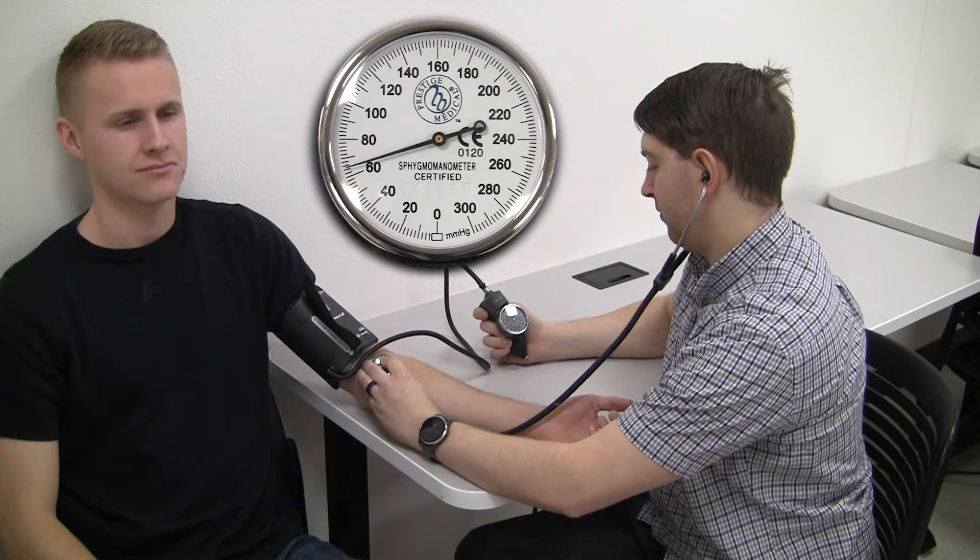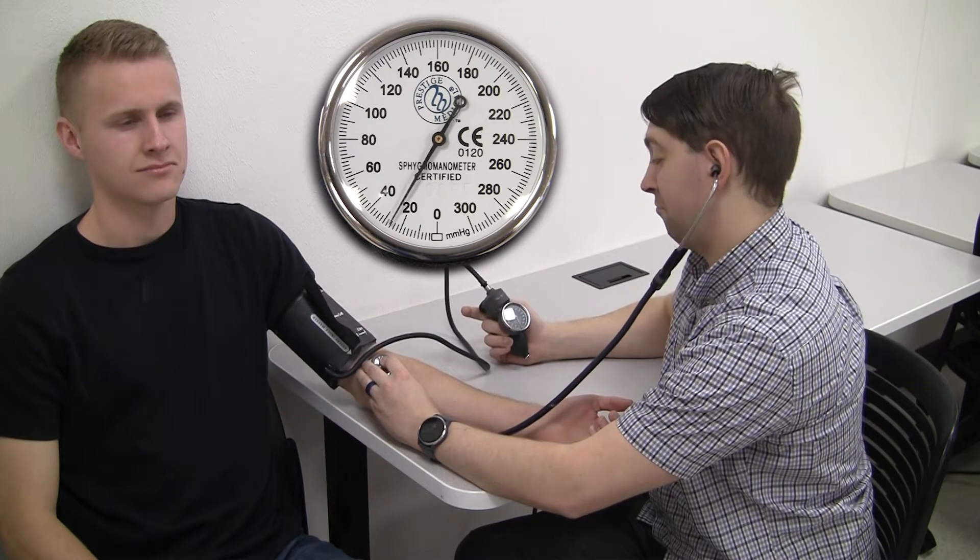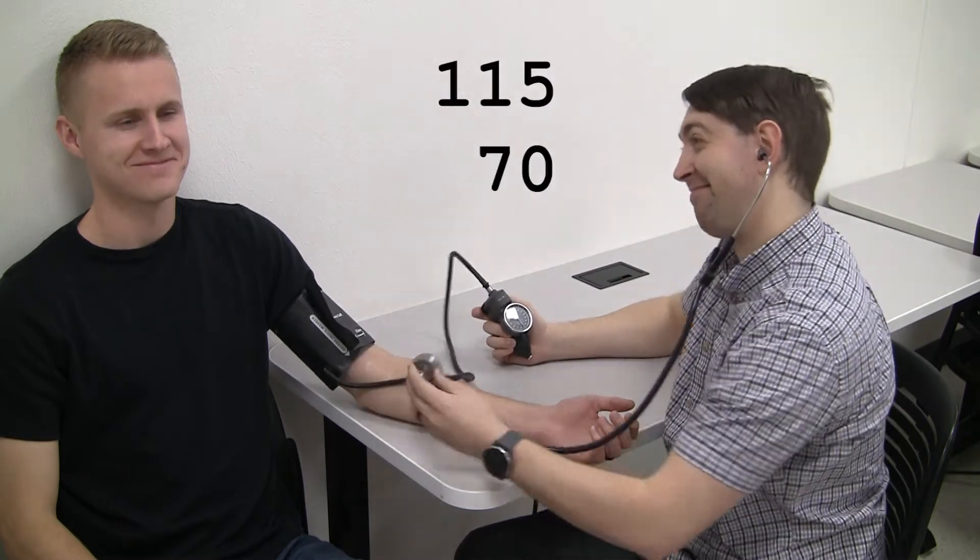We'll keep slowly releasing pressure until the tapping stops. It stopped at 70 mmHg — this is the patient's diastolic pressure. We'll deflate the cuff and record that their blood pressure was 115 over 70.